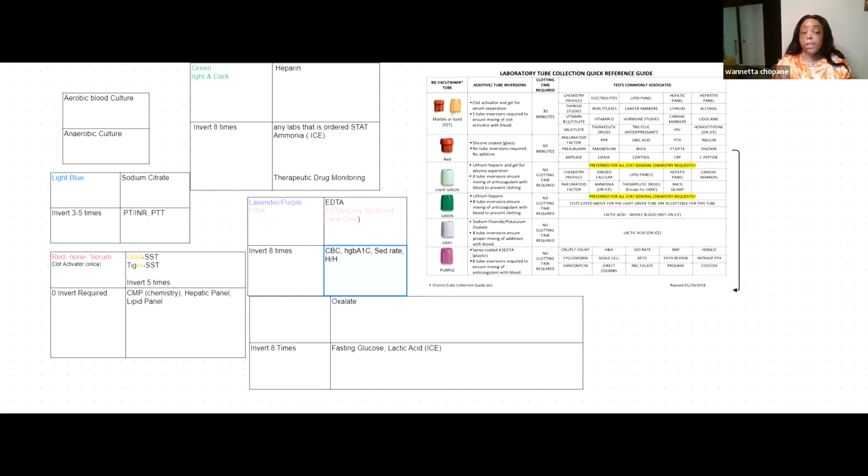Next, you see I have HbA1c. That stands for hemoglobin A1c. That is a most common test in that purple top tube. That's how a doctor would know if a person has been diabetic for a while. That result will let someone know how someone's blood sugar has been running over a 3-month period. Not the blood glucose sticks that we do that you get back rapidly, that's point of care testing, but drawing your blood to see where your levels stand, and it basically checks for diabetics.